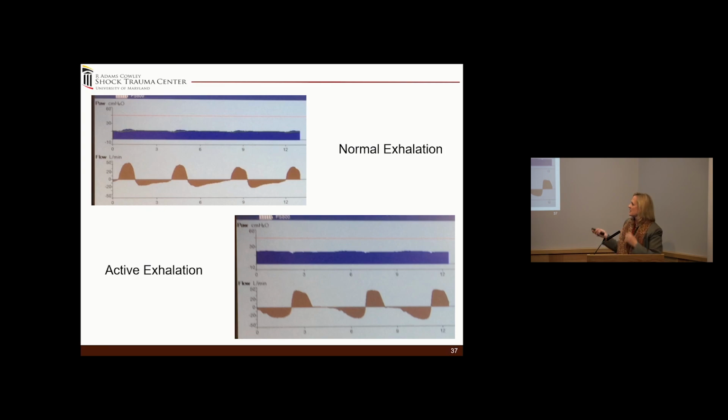And just expand a little bit. So here is an active exhalation. Look at where the load on the expiratory side is. It's here. This is normal, sorry. The passive exhalation, and then it decelerates. Versus the opposite. If you flip this around, the patient loads towards the end, and again, they're defending their lung volume.